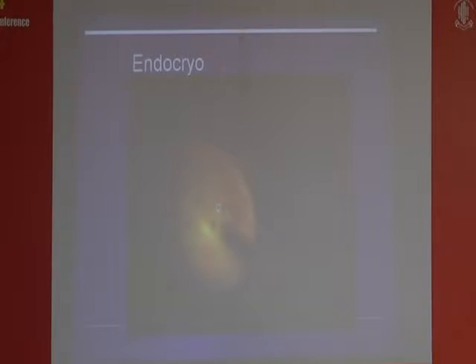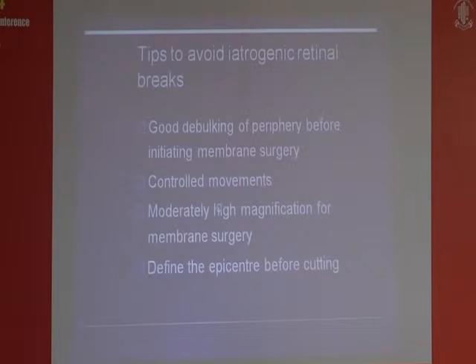Laser is another difficult problem because of chronic tractional detachment. It's difficult to get the laser marks. It's difficult to even do a complete fluid gas exchange. Here we can use, in selected cases, endocryo to the edge of the break.